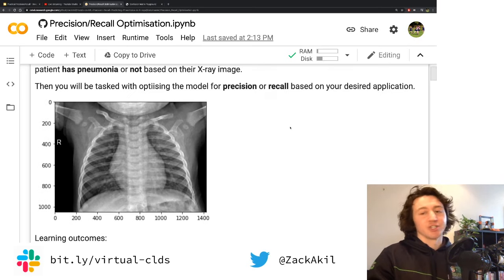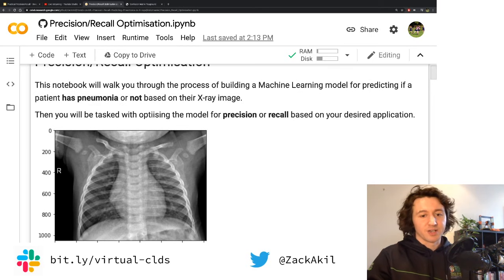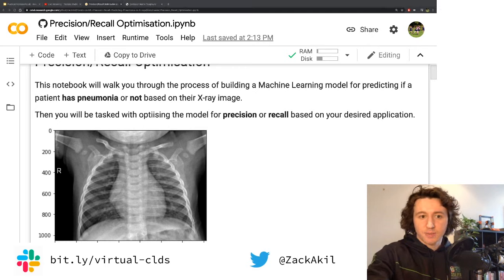And the first thing you're going to do when you come into this notebook, wait for a couple of people to get into it. Let me actually, I've got a special tool.